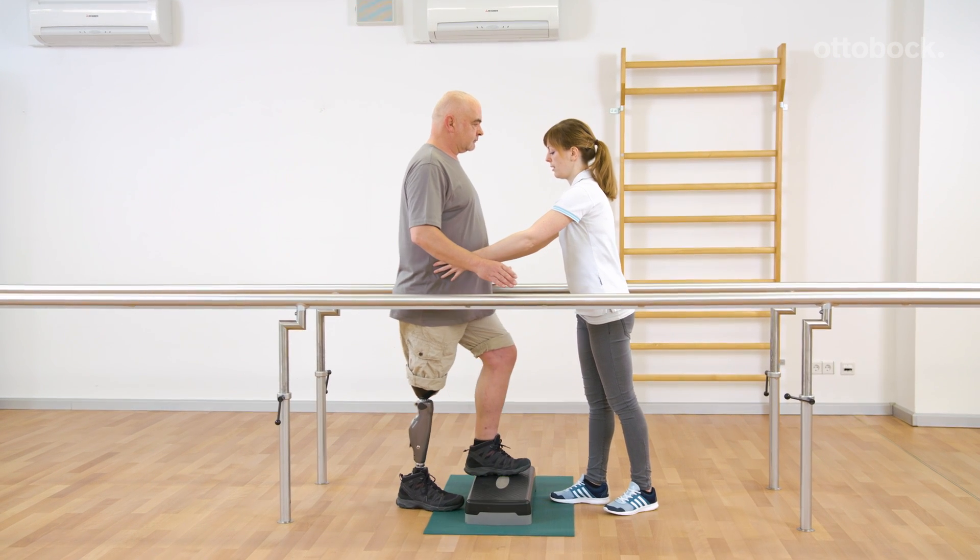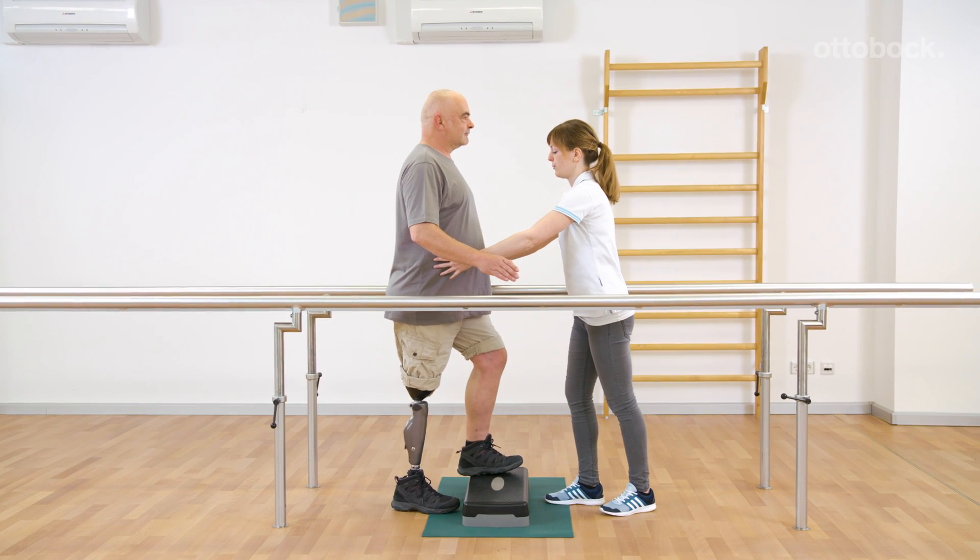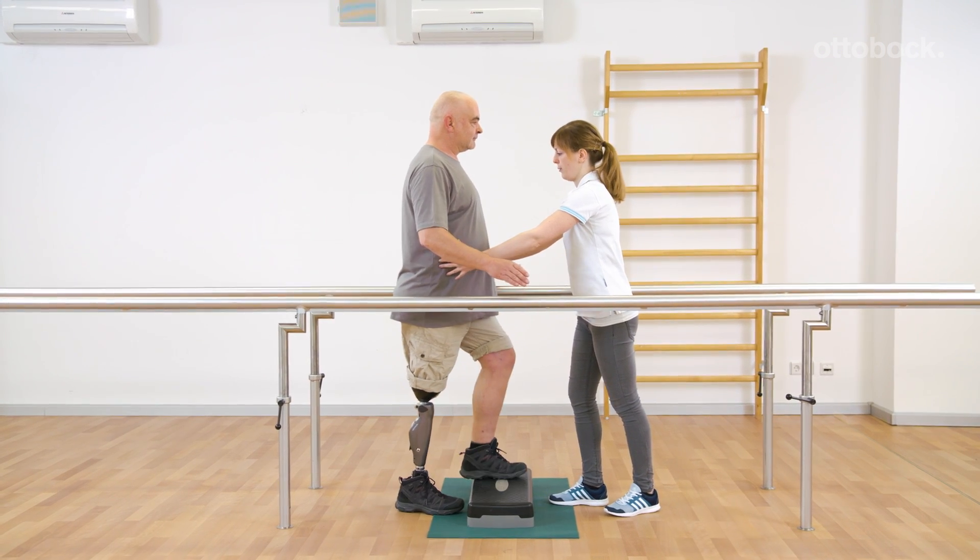Franziska shows how to increase the level of difficulty step by step. Security measures are reduced and later combined with arm movements.